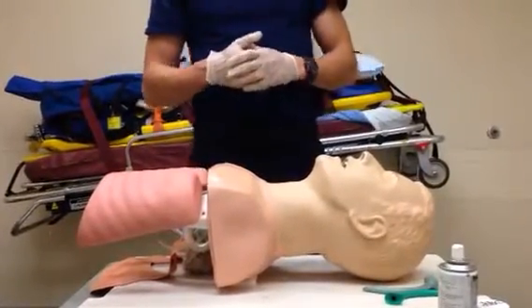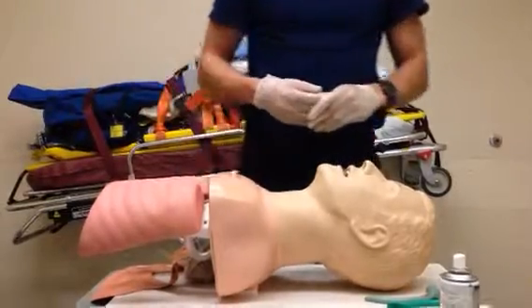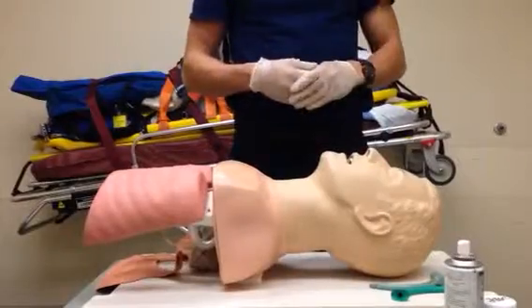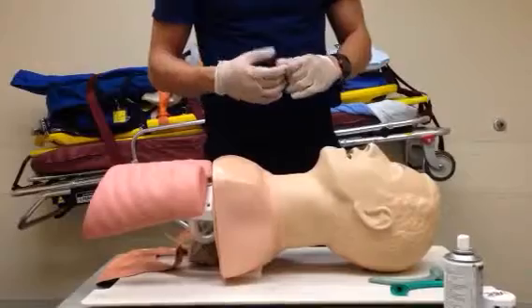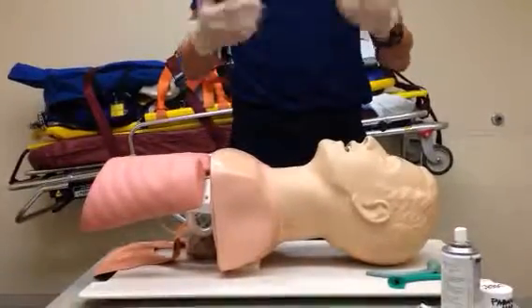Hi, my name is Christian and here I'm going to show you how to use the nasopharyngeal airway. The nasopharyngeal airway is used to secure the airway in an unconscious patient. It's a good device to use when you cannot get a patent airway using the OPA. I'll go ahead and demonstrate how to insert the NPA and then I'll explain it step by step.